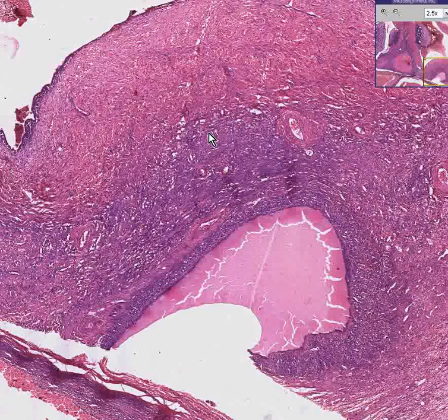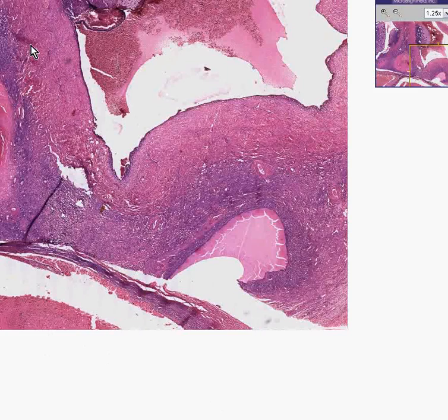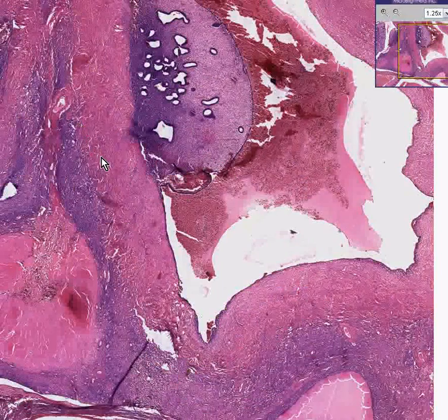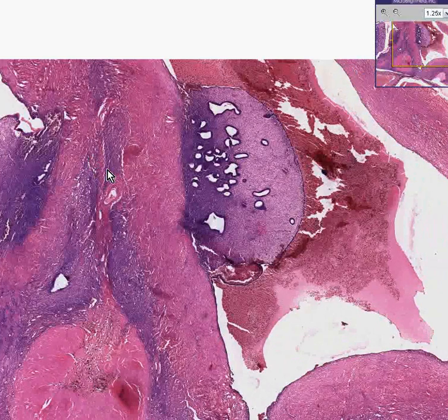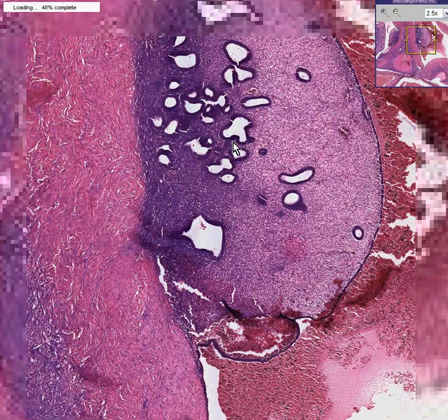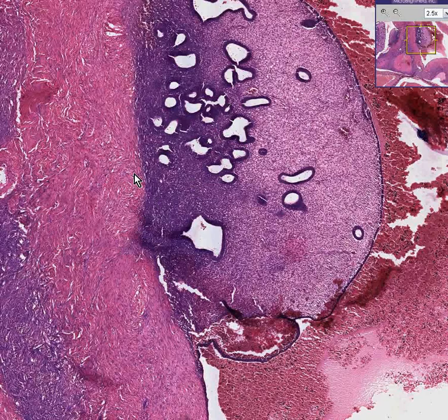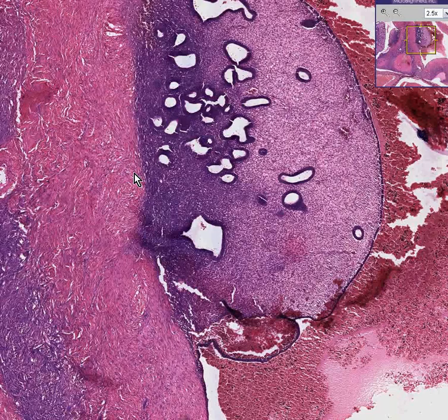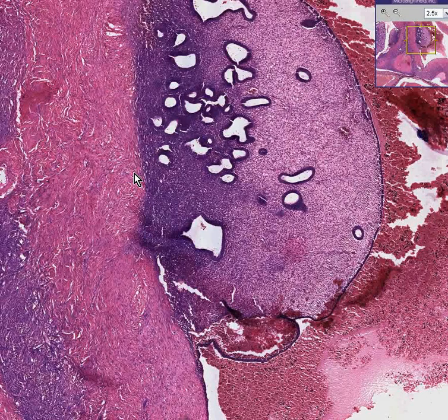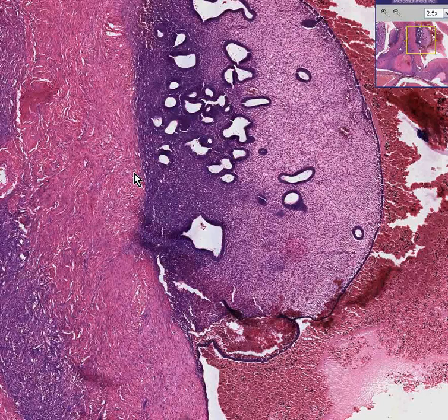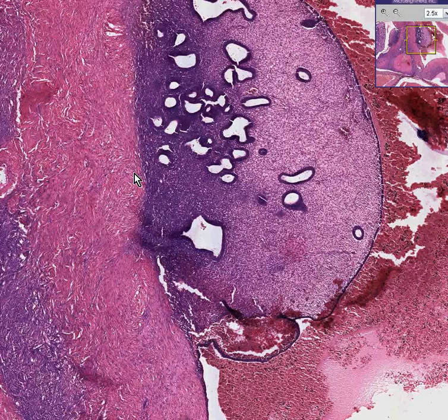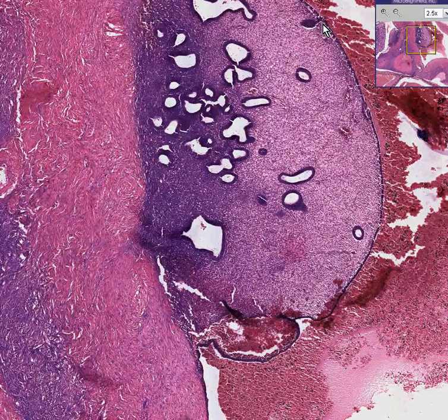But if we back off a couple of notches and move around a little bit, whereas you were fully convinced this is ovary, now you're saying, 'What the heck happened here — did the pathologist mix up the endometrial tissue with the ovarian tissue?' Because this looks so much like classical endometrium. Well, it is classical endometrium, but it happens to be plastered onto the ovary. This is endometriosis — a case where the endometrium, which should be confined to the inner lumen of the uterus, goes to other places like the appendix, colon, mesentery, or peritoneum. The ovary is probably the first or second most common site this wandering, aberrant but normal endometrium likes to go.